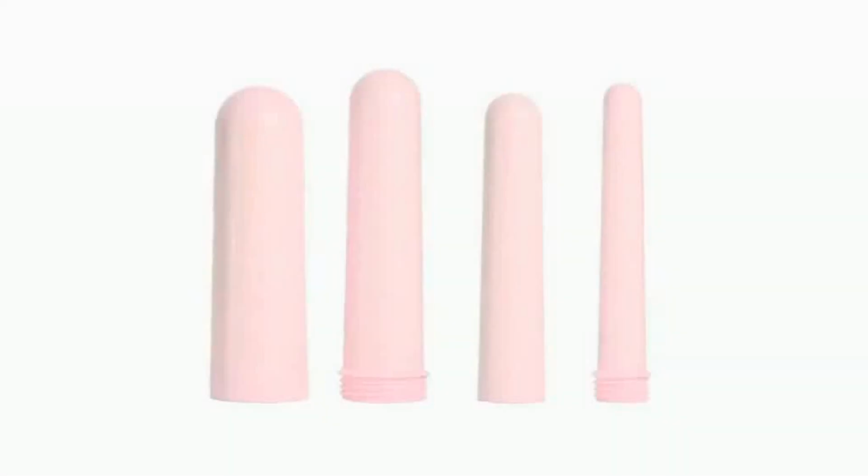If you've had radiotherapy, once you've inserted the dilator, it is important that you move the dilator in the vagina from side to side and also forwards and backwards. The idea of this is to try and stop any scar tissue forming within the vagina.